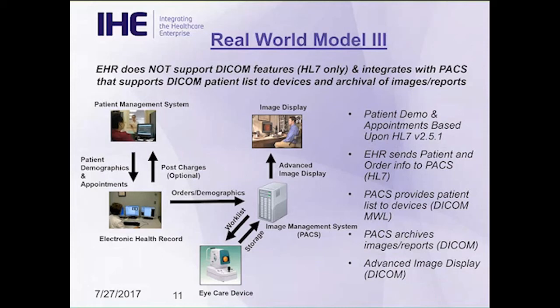It knows how to do HL7. It manages those demographics and those appointments, and it can create HL7 orders. However, it doesn't understand the DICOM specification. So what happens is the image management system takes that role for the EHR. It says, I'll do it for you.